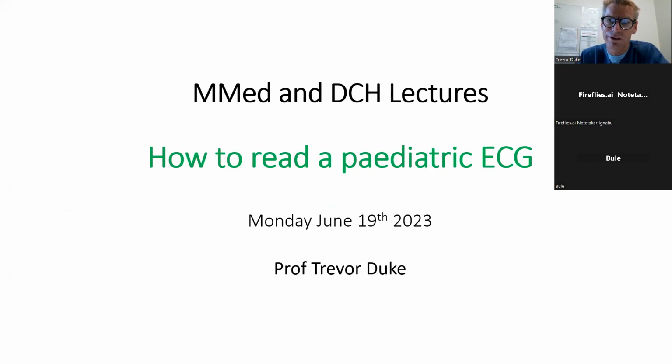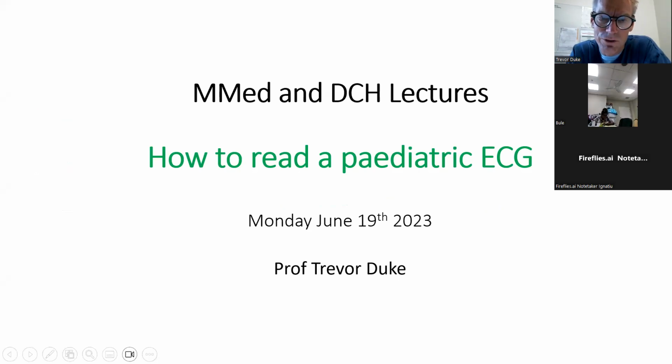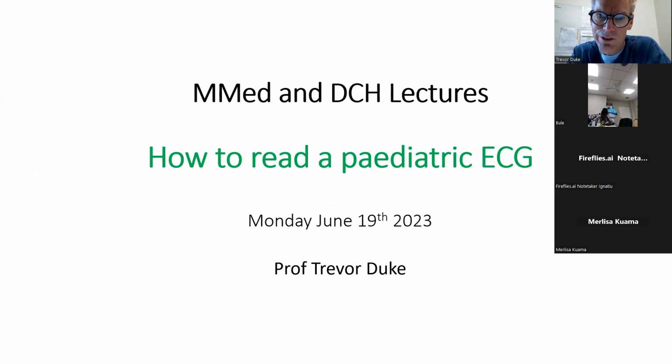I sometimes do this teaching in person where we go through some ECGs, but I just thought I'd talk about the theory around how to read a paediatric ECG and a simple way to do it. If you know the system, then you can practice it when you do ECGs. And I know there have been some ECG machines recently bought and being used in the emergency department and elsewhere.